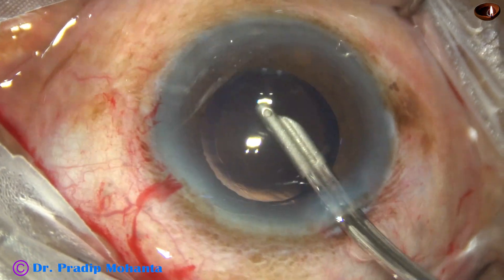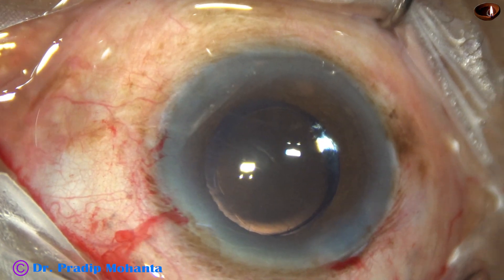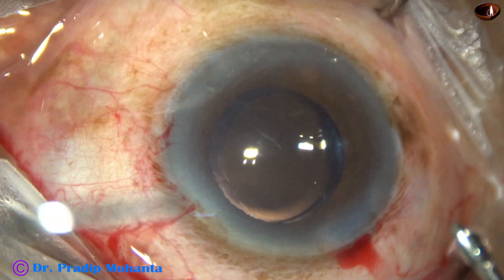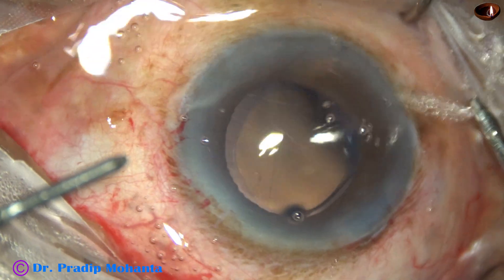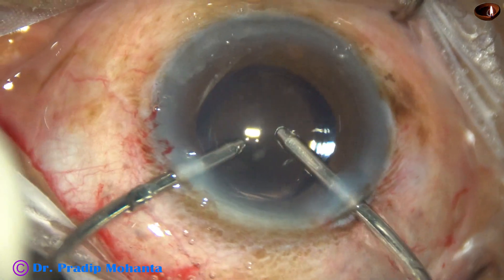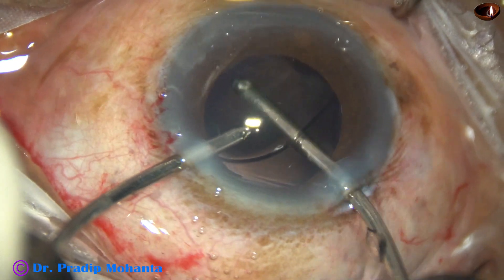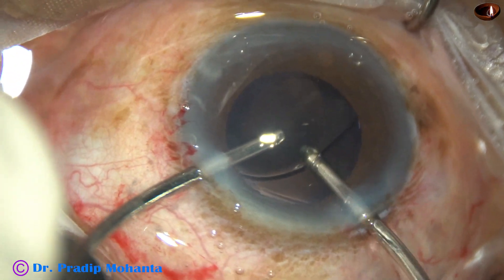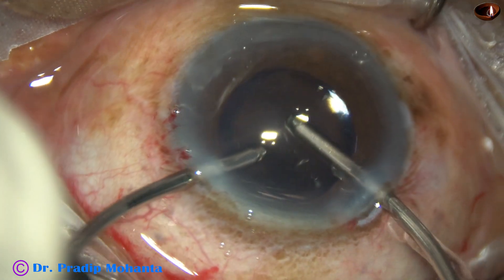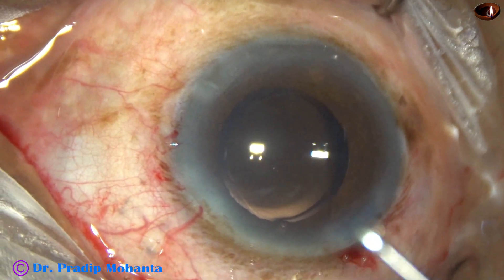I spend a significant amount of time for cleaning of visco. This is not the end of visco cleaning — I am going to use bimanual irrigation aspiration also for visco cleaning. Going behind the intraocular lens, irrigating the capsular bag and aspirating from above the lens. Some more irrigation and aspiration of the anterior chamber, and the anterior chamber is crystal clear.